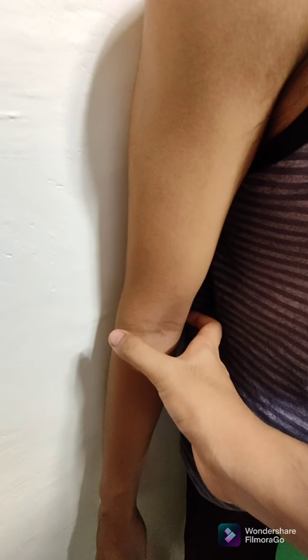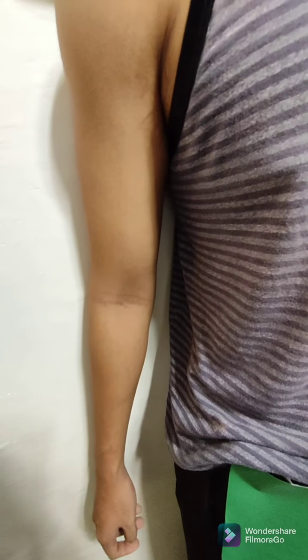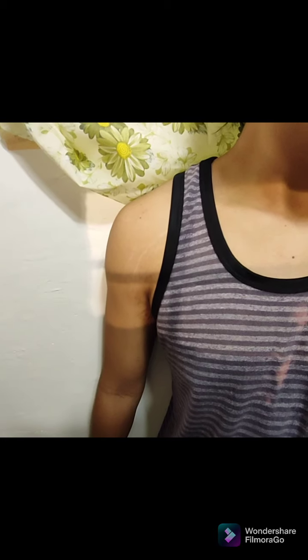And the epicondyles of the humerus are approximately 45 degrees against the plane of the IR. Makikita natin dito, ito ang line niya. And dito banda ang IR. So, approximately mga 45 degrees ang orientation ng epicondyles. And so, after natin ma-ensure ang position of the part, proceed with the central ray.